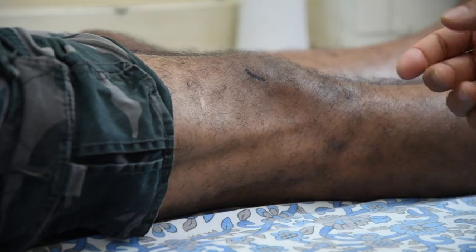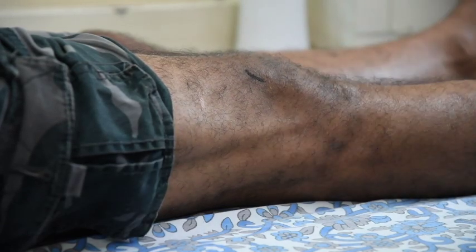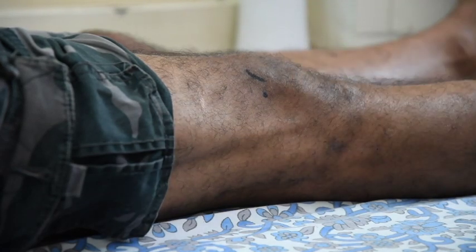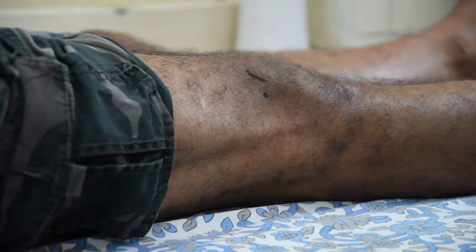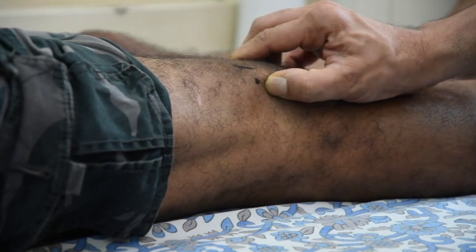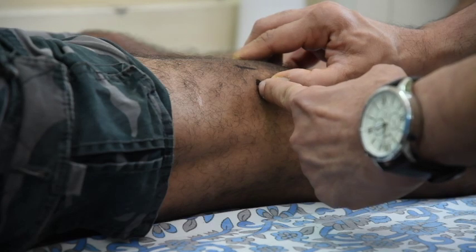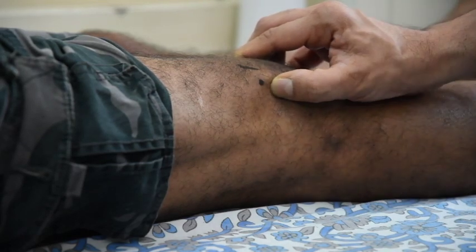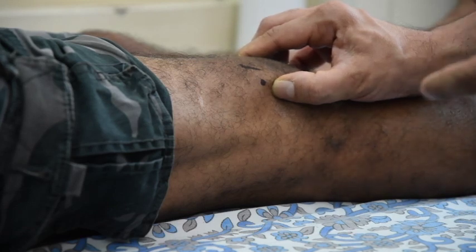This technique is much more accurate and useful in obese patients — this patient is thin and lean. Once you mark the superior pole of the patella, come around 1 cm down and mark a point which is the point of your injection. At this point, raise a small bleb of local anesthetic so the area is numb; it takes around one minute for the injection to act. While injecting, hold the patella, push it a bit laterally and divert it slightly. The access is simple — inject the needle parallel to the ground and parallel to the patella. As you go in, you feel a giveaway sensation, then aspirate and inject. In case of an effusion, this approach ensures correct needle placement. This approach has 91% accuracy.